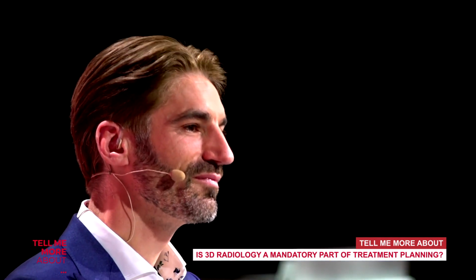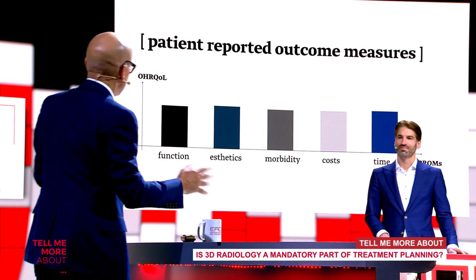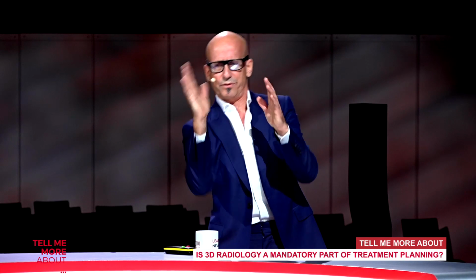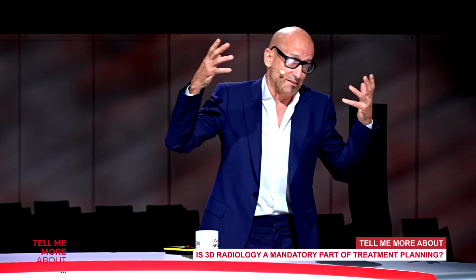It's much more complicated because the demand and our science has clearly shown we have to create something special around the implant. And I want to give all my emphasis during the surgery to this and not to think about the inclination of my implant. I don't want to take care about that. This is easy. Basically, screw in the bone. How far away from this tooth and what is the inclination? I'm happy to have this done by the software and by my template, and it makes my day doing the surgery much easier. And that's why, even in easier cases where I could do it without navigation, with my experience, I like to have it. I do it, honestly, 70% in our clinic navigated. So that's it.